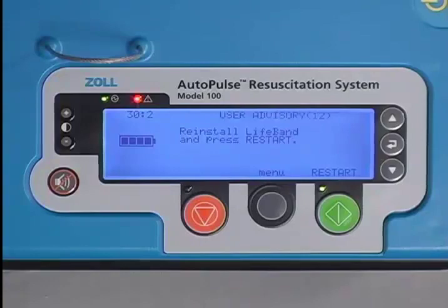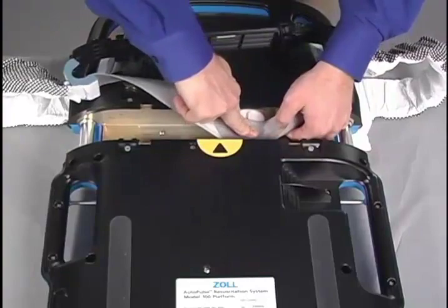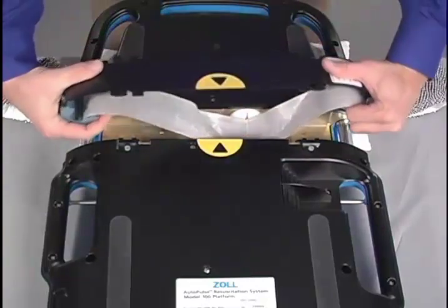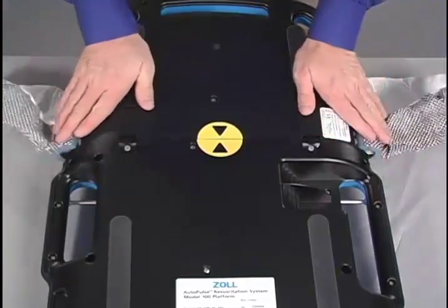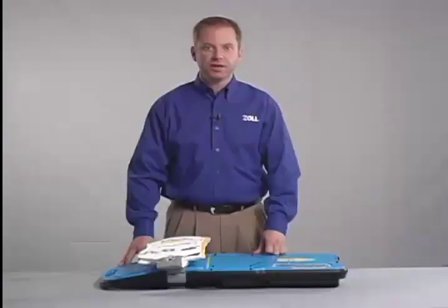If this occurs, repeat the installation steps. The lifeband should only be removed and replaced according to this procedure. The lifeband should never be cut. If a lifeband does get cut for some reason, follow these steps.